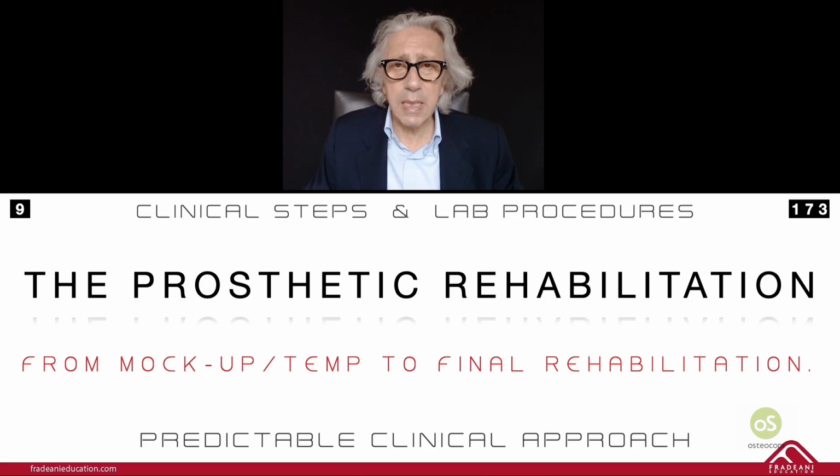The title of my lecture today will be the prosthetic rehabilitation. I would like to show you the step-by-step procedure, clinical and lab procedure, in order to really fulfill the request of our patients and to be able to finalize your extensive rehabilitation in a proper way. So we try to give you a kind of predictable clinical approach.